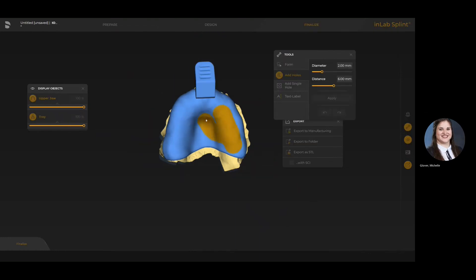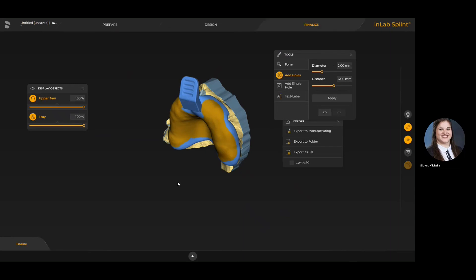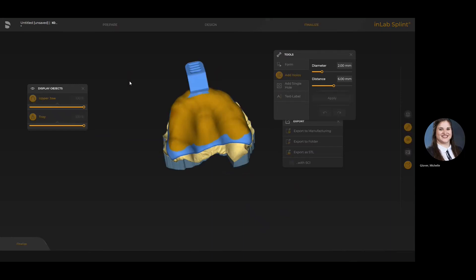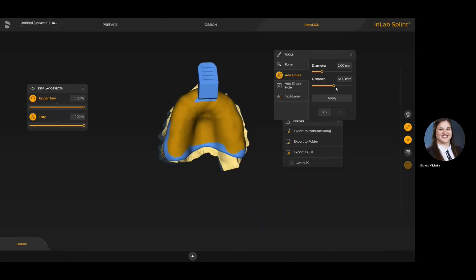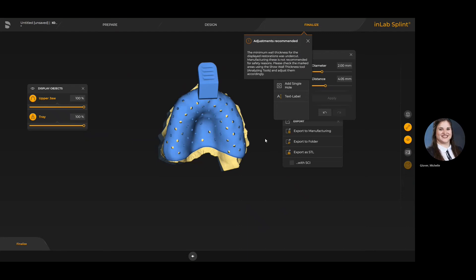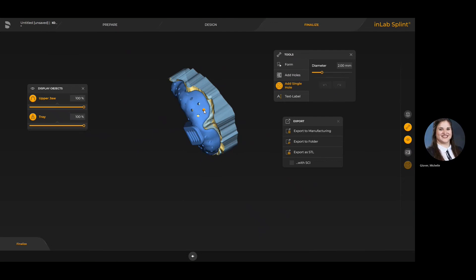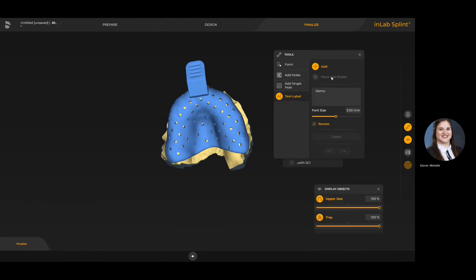In the finalized stage, if you want to add retention holes you hold down your left cursor and highlight the areas where you want holes. If you hold your right cursor down and move the mouse up and down, you'll change the size of the cursor to cover more or less surface area. You can control the diameter of the holes and the distance between each hole, then hit apply to apply them to the tray. For adding just a couple of extra single holes, use the add single hole option — almost like a hole punch — and just double click where you want to add an additional hole or two.